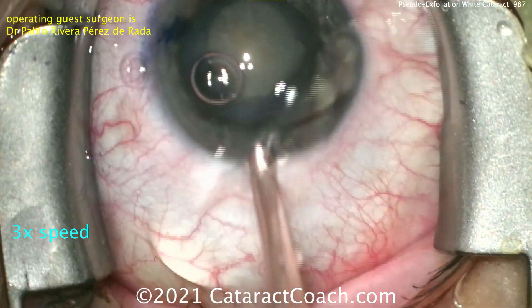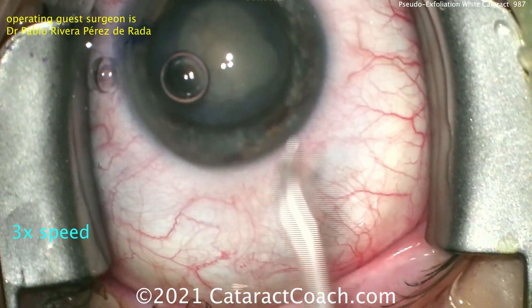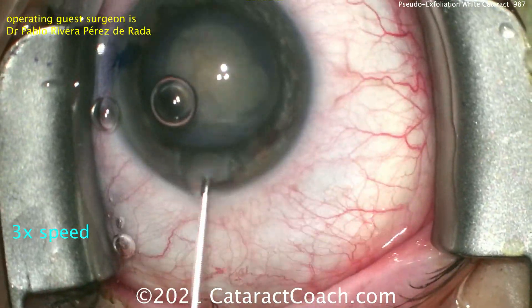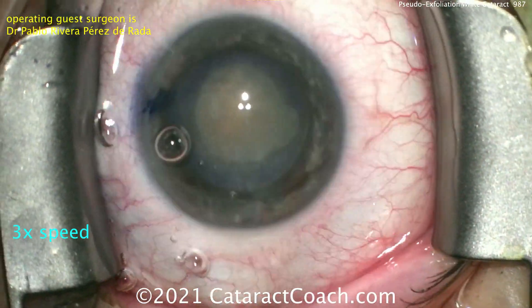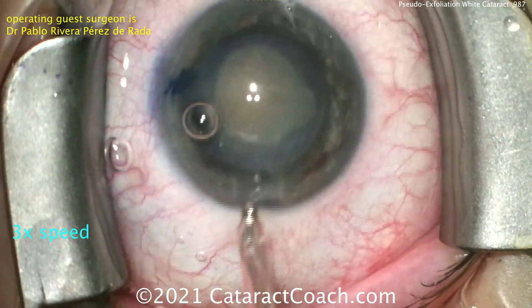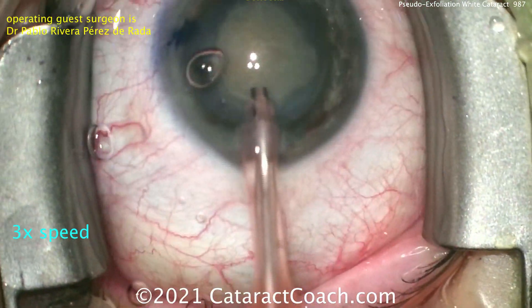Now the divide-and-conquer technique is a good technique, and it's going to perform very well in this case. It's a technique that I don't frequently use, but a lot of surgeons here in the U.S. use it, and certainly a lot of the training surgeons use it at the beginning of their careers or during their residency program.